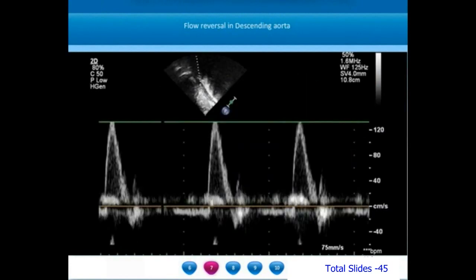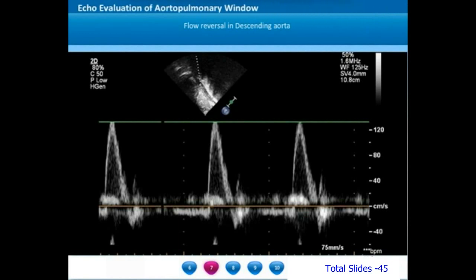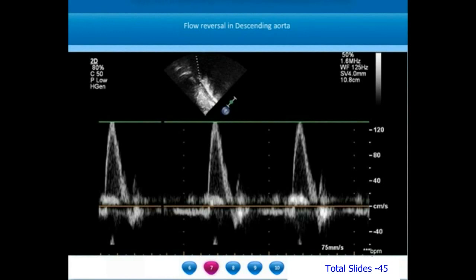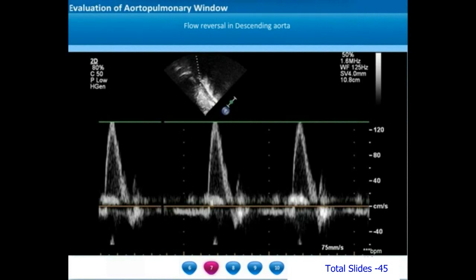When we interrogate the spectral Doppler pattern in the descending thoracic aorta, we see a pulsatile systolic antegrade flow. However, in diastole there is a low velocity holodiastolic reversal. This is the cause of runoff from some portion of the ascending aorta or arch of the aorta, and one of the causes for runoff from the ascending aorta is aortopulmonary window.